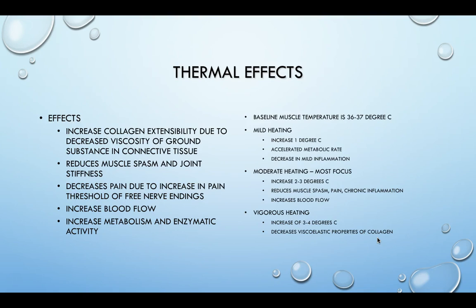Another example would be like Achilles tendonitis. So when you get Achilles tendonitis and you get that really tight Achilles cord, we could be doing ultrasound at the vigorous heating level, and actually while we're doing the ultrasound, keep them on a stretch. So pull them up into dorsiflexion so that as that tissue heats up, it's already being stretched. And then we do that all through the treatment, and then we can do some more aggressive work for, again, about 5 minutes after the treatment as well.